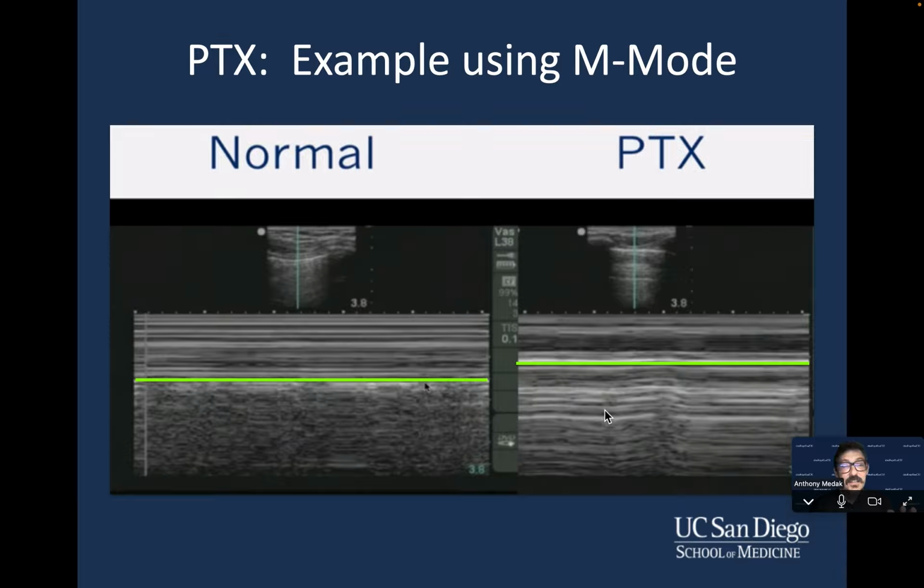Again, this is not a technique you must use. It's a secondary technique that you would use in the event that the sliding or no sliding question is unclear to you.